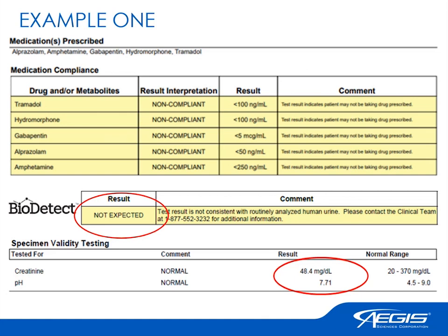These provide a more difficult interpretation, and a lot of times we are able to give scenarios. One in particular that's recently been considered is that the individual who brought in the synthetic urine or the substituted sample transported that in a container that maybe had cocaine or methamphetamine residue in it. So that's just an example.